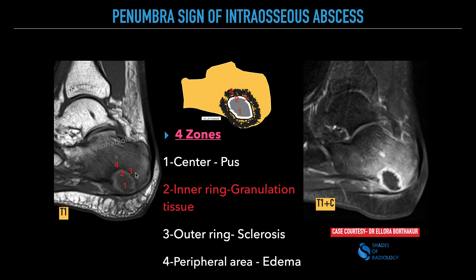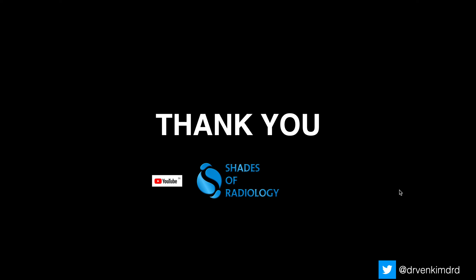This is a classic picture of intraosseous abscess with the penumbra sign, which is nothing but the T1 hyperintense inner ring indicative of granulation tissue, showing significant enhancement on post-contrast images. I would like to thank Dr. Ellora Borthakur for providing this excellent classic sign which is indicative of intraosseous abscess.